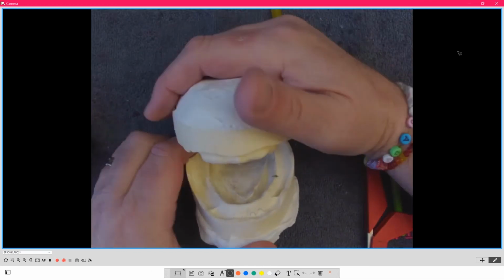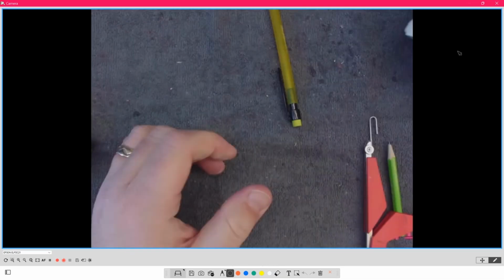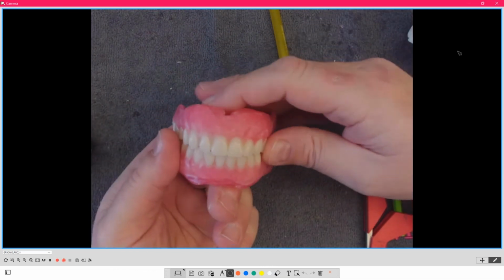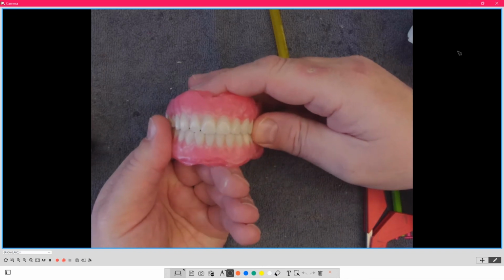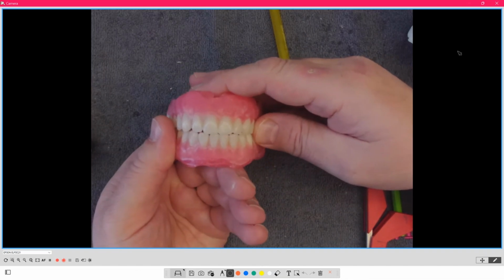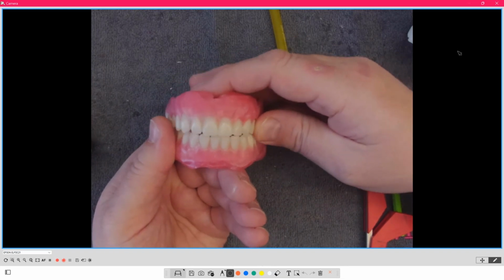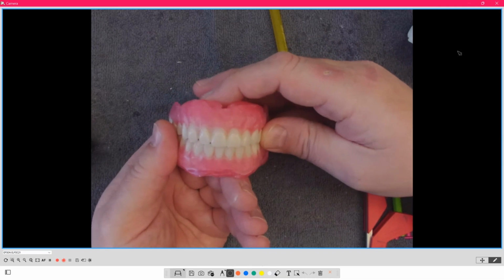And then again, making sure that you're going through a chew cycle to make sure that the teeth are functioning within that chew cycle of the person. Okay. So again, I spend less concern about true working and balancing than I am about how this thing is going to function like this in the mouth. And that's how I've crafted and tailored this.